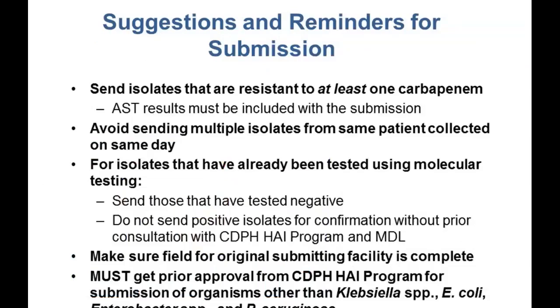So now I'm going to switch gears to talk about sample submission. Isolates submitted for testing should be suspected CRE and CRPA isolates. So please send isolates that are resistant to at least one carbapenem, and please include the antibiotic susceptibility test result with the submission. We encourage you to avoid sending multiple isolates from the same patient collected on the same day.